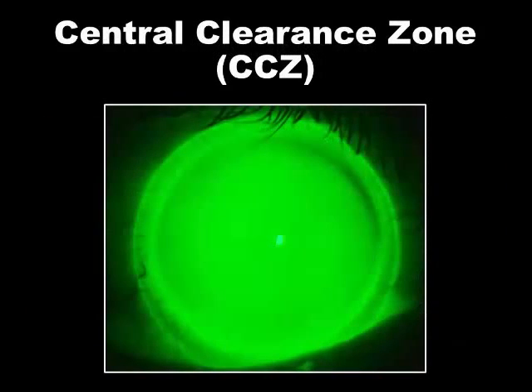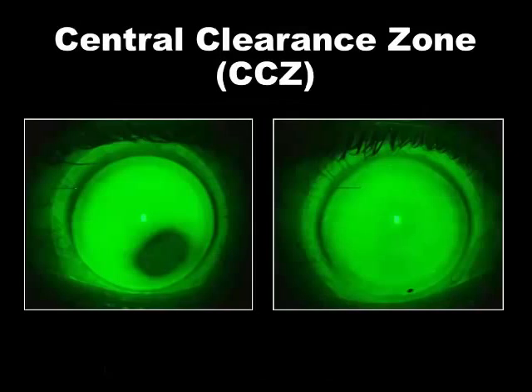Now again, with the ICD 14.5, we're going to look first at the central clearance zone. And what we're hoping to see is a beautiful vault through the central cornea with an absence of any corneal bearing. If we place a trial lens on eye and it hits the corneal surface, you know you need to go higher in sagittal depth. If it's touching, you want to be at least 300 to 400 microns higher in height to make sure we clear the cornea.